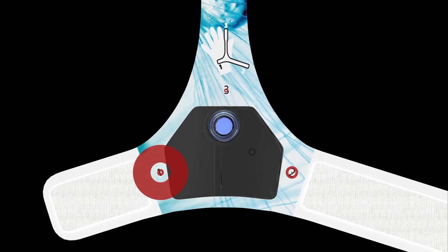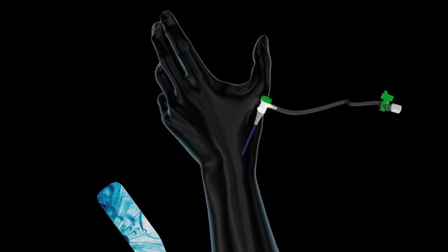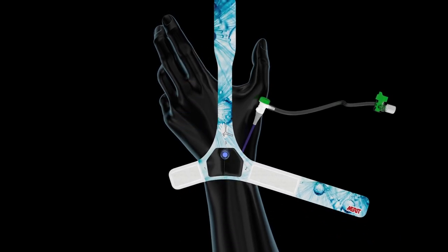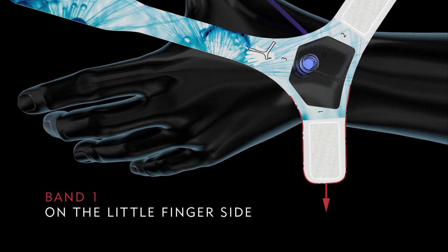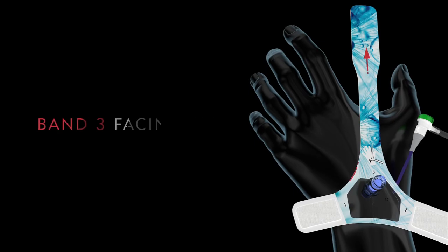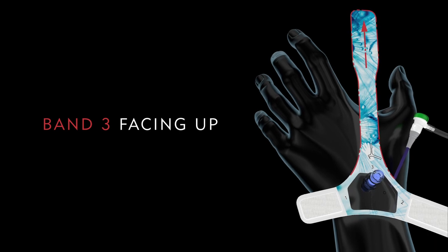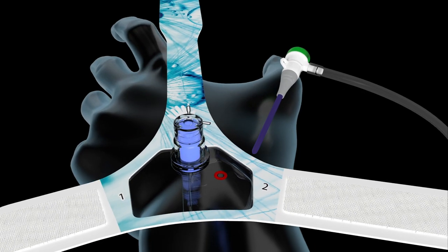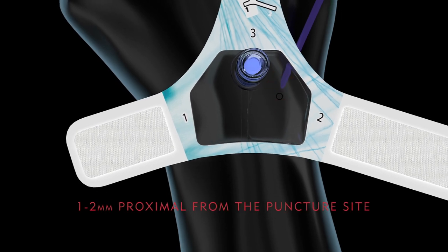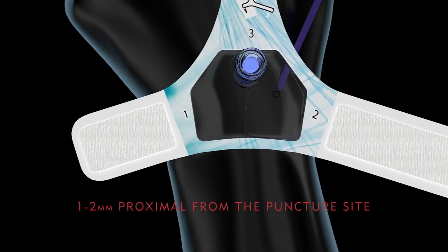Prelude Sync Distal features three numbered bands. When you're ready to place the device, position it carefully on your patient's hand and wrist with band number 1 on the little finger side, band number 2 on the thumb side, and band number 3 facing up towards the thumb. Next, place the center of the balloon target over the arteriotomy, approximately 1 to 2 millimeters proximal from the skin puncture site.